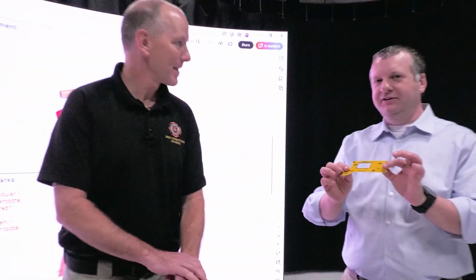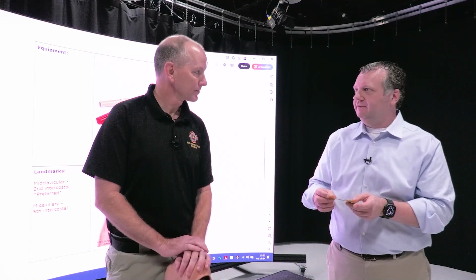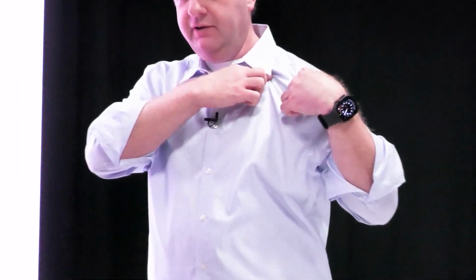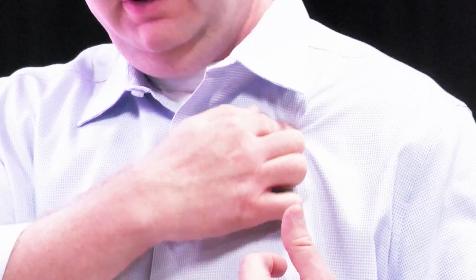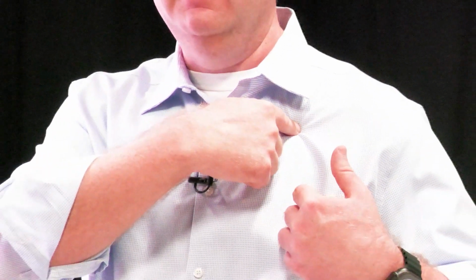This is not for anterior use, obviously. A lot of people do have trouble identifying the anterior landmarks as well. Just remember when you do that, the clavicle is pretty far. Mid-clavicular is about here. If you feel your clavicle and go down one, you're at one rib space. Here you're at the second, so you can see how high that is. I've seen needle decompression where people come in with needles down here, and the second intercostal space is pretty high.